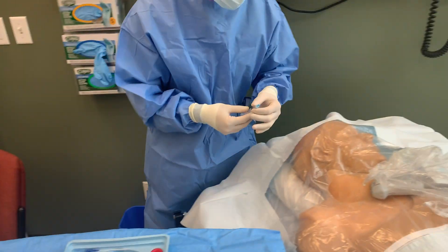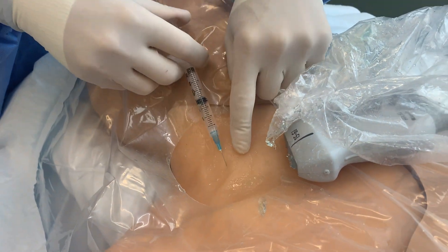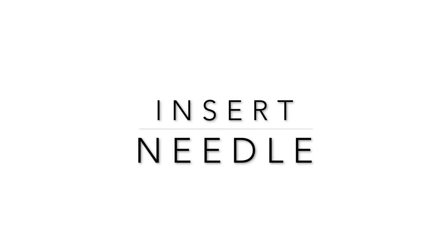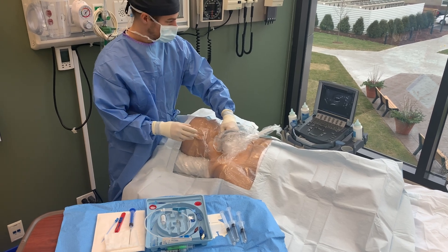If your patient is awake, use 1% lidocaine to localize the skin. With your ultrasound probe in your non-dominant hand, identify the patient's anatomy.